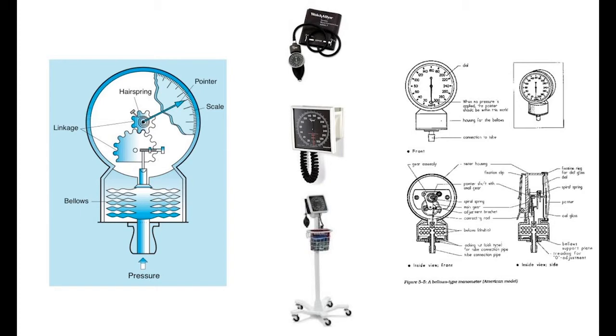You have to be able to show in 50 millimeter of mercury increments around the gauge that when it says 200, some device connected to it in a Y fashion also says 200. And that's where half the calibration issues come from. And we don't usually measure that. We look at the gauge, the needle's in the little box at the bottom, we're good to go. And guess what? We are not good to go. So there are a lot of moving parts in this phenomenon.